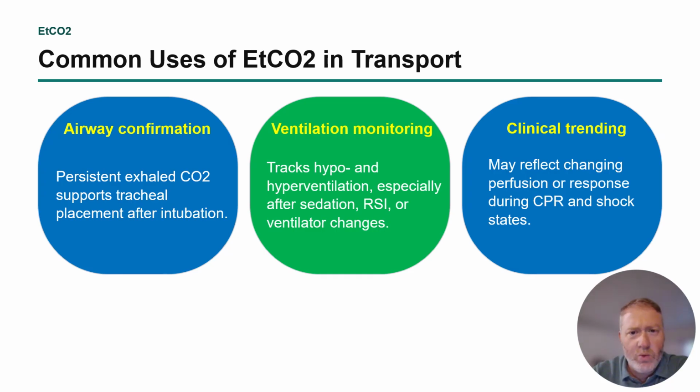Ventilation monitoring. Once they are on BiPAP, or if they're on a transport vent, then hooking up an end-tidal CO2 can be extremely helpful for you to track any changes. So any impending hypo or hyperventilation, especially after sedation, post-intubation, and also after you make any changes to the vent. And then, of course, clinical trending may reflect changing perfusion or response during CPR and shock states.